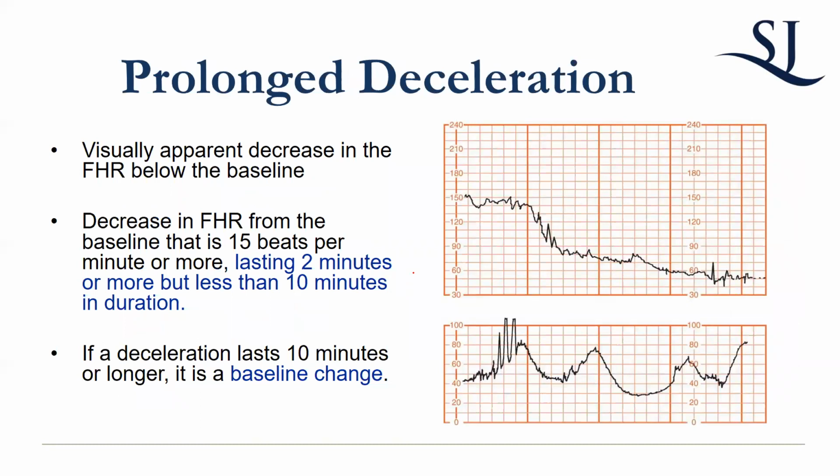So that's what I meant when I said things kind of do follow suit, though. They are independent, but certain clinical situations line up. Like it wouldn't make sense to have marked variability and something like that. But you can have late decelerations and have moderate variability, for example. Usually you have that situation when there's a problem with the placenta itself, but baby's fine, like a placental abruption sometimes looks like that. Because there's a problem with the blood flow, but the blood flow of that baby's fine otherwise. And it's because the placenta is going to pop off. That's really why it is. So sometimes that's how you segment it. But that's why usually you can identify it as something.